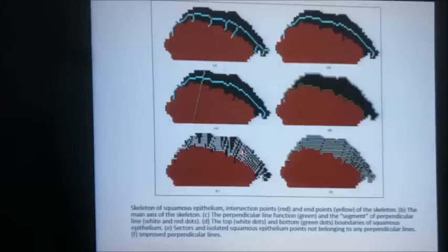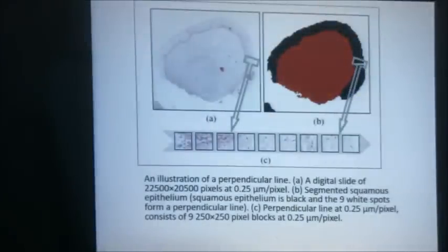As you can see here, small parts of the images are extracted and then put together in order to find out, by the machine, whether there is CIN1 or CIN2. You can see the density of the nuclei here has a pivotal role in knowing whether this is CIN1 or CIN2.